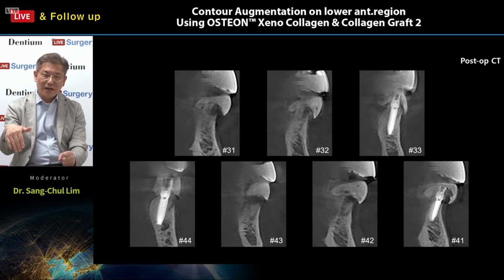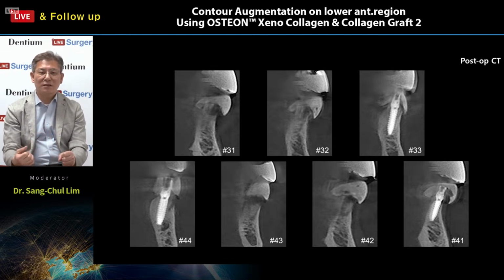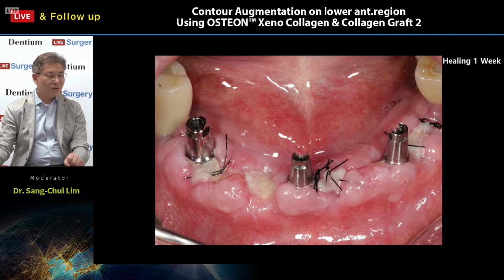After that, starting with the osteotomy, the ideal angulation and depth were achieved, and the implant connected with a comfort cap was inserted here.